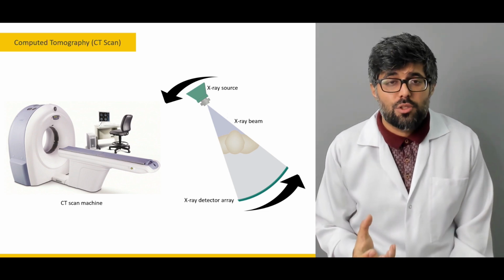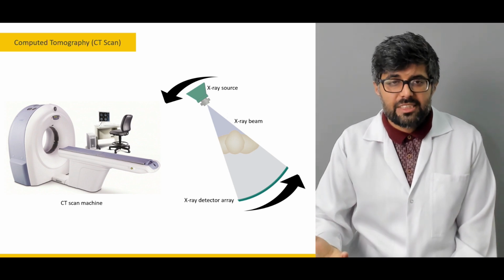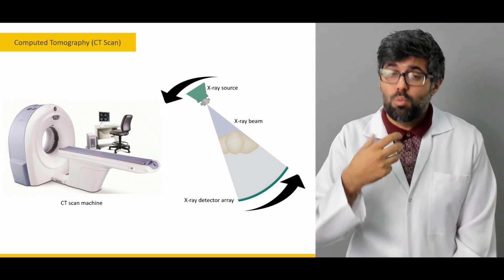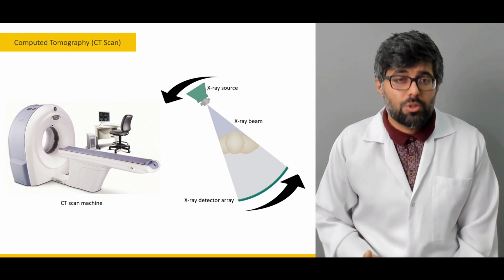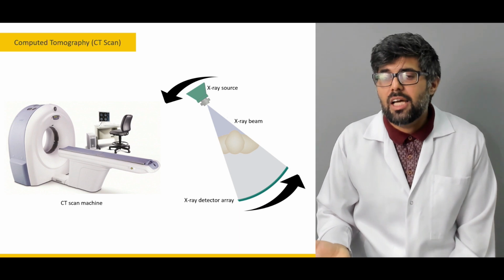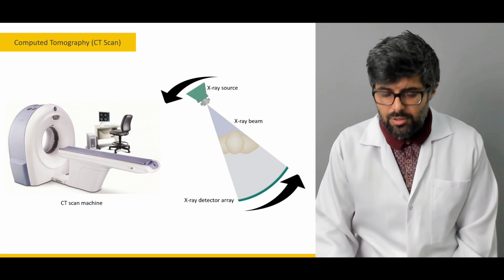And that image is what we call a CT scan image. That image usually gives us more knowledge, more information about the body, depending upon which kind of slice it is, or the plane. We'll study that in a bit.